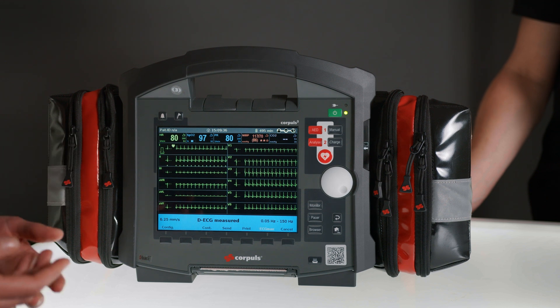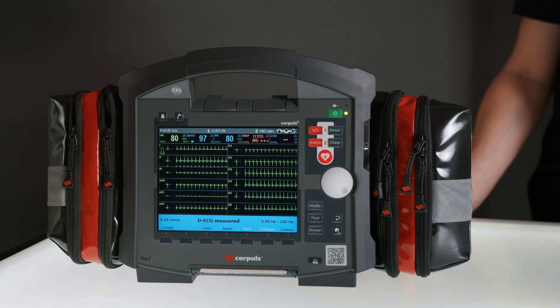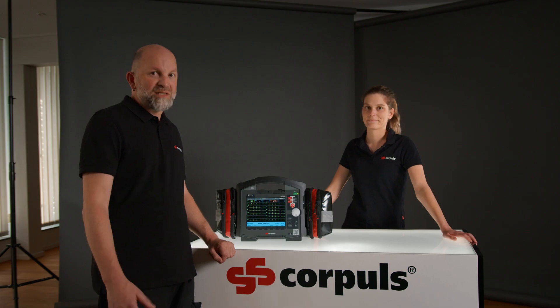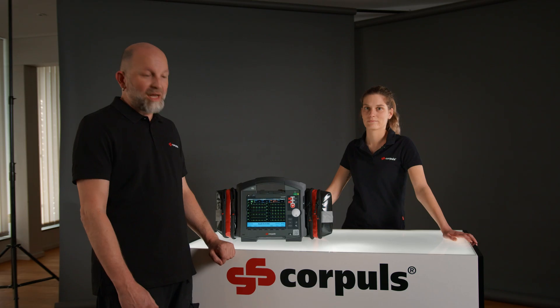Once the diagnostic ECG has been measured, I can print it out and then use this printout to make a diagnosis. Some selected pathologies are already detected during the measurement phase and are displayed using a visual and audio alarm.